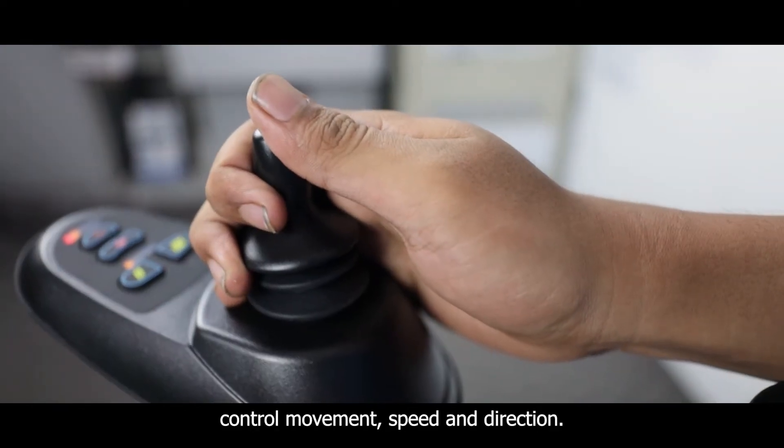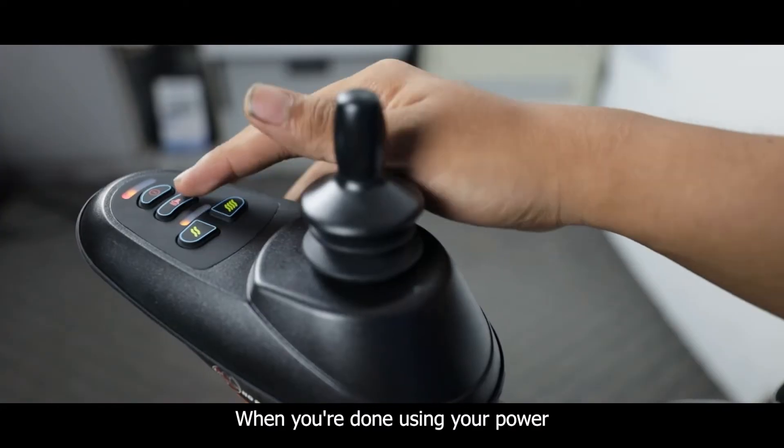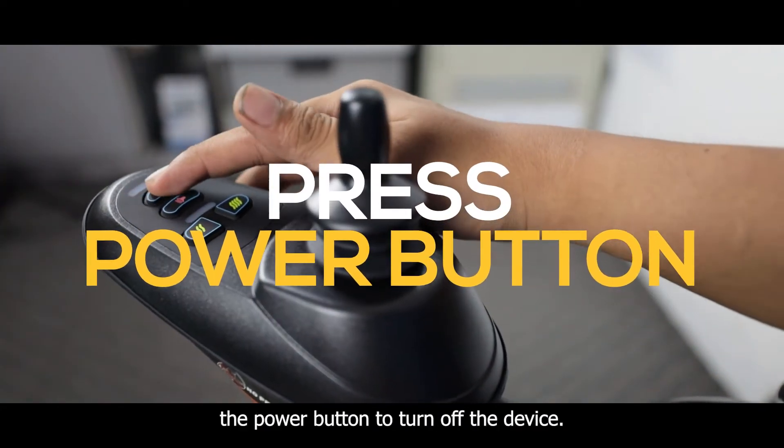Use the joystick to control movement, speed, and direction. When you're done using your power wheelchair, simply press the power button to turn off the device.